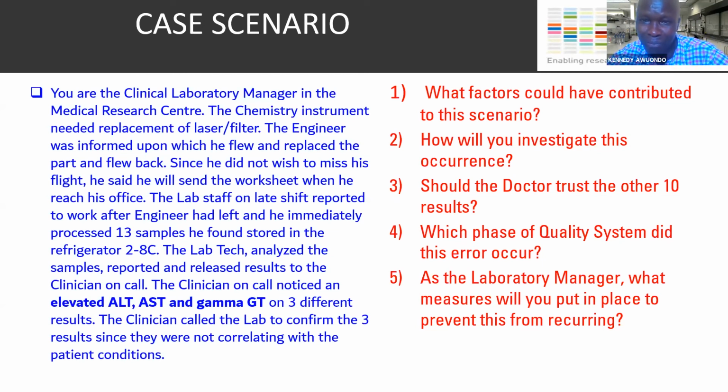I agree. Okay. So Albert Chama says, to investigate, you first check the calibration and the QC data sheets. That's from Albert Chama. I agree. Wangwe Nicholas says, worksheet must be produced. I agree. Very correct. The worksheet comes from the engineer.